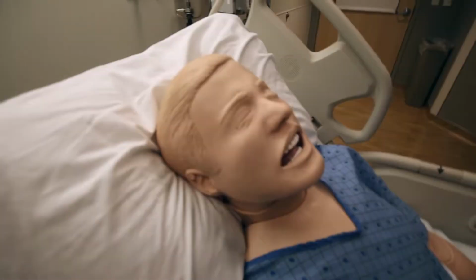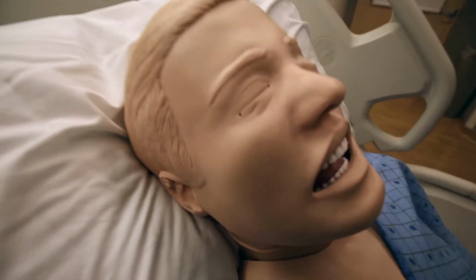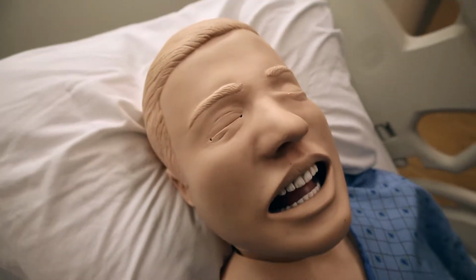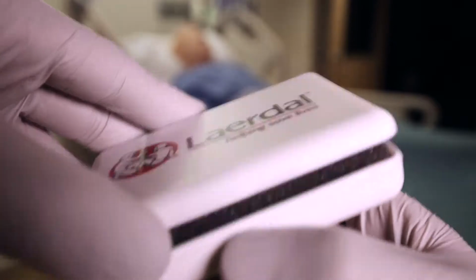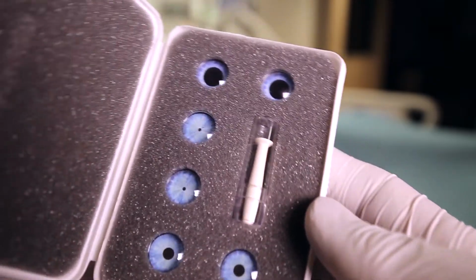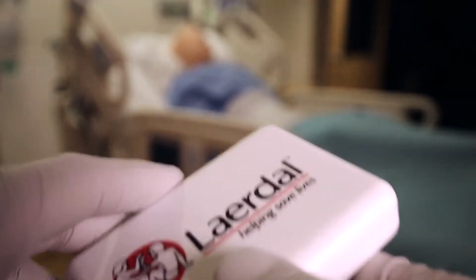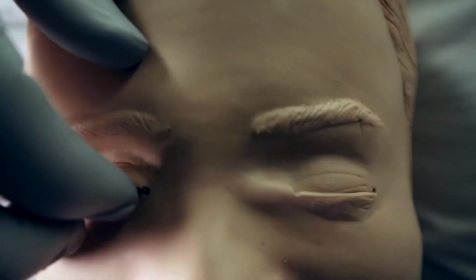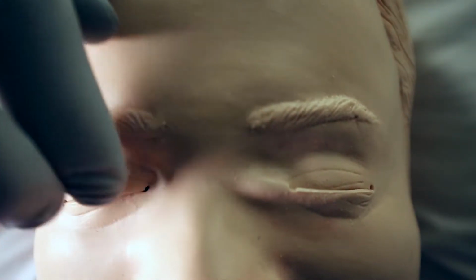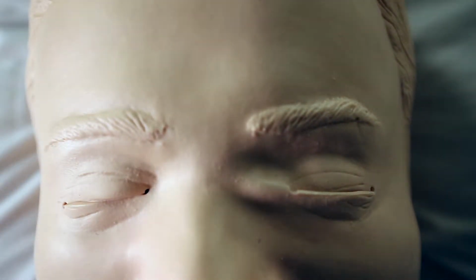The patient simulator's eyes are always closed. Even if your patient is awake and alert, the eyes will still remain closed. You can, however, examine the mannequin's pupils. Pupils can be replaced and changed between sessions. To examine the pupils, peel back the eyelids on your patient. Pupils are not reactive to light, but may be different depending on the scenario that is being run.